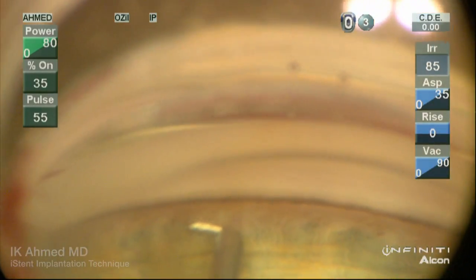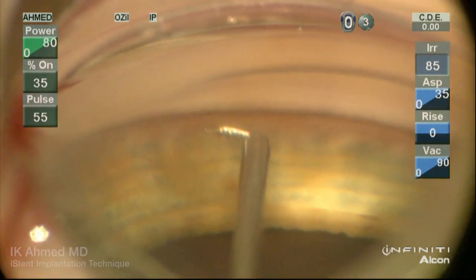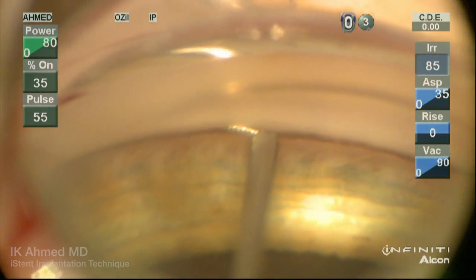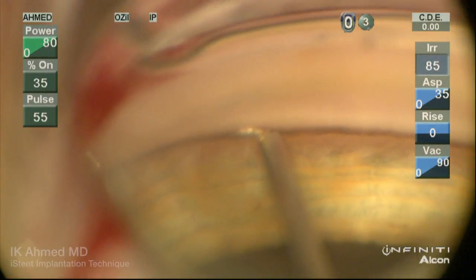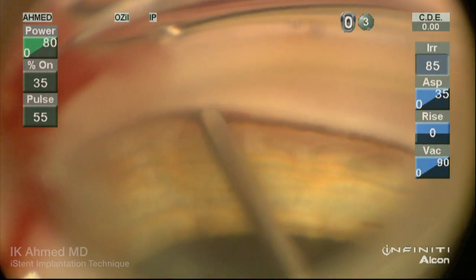In the supranasal angle, we're going to enter the meshwork at a 30-degree angle, noticing the self-trephinating tip approaching the inner wall with this 30-degree acute angle. This allows adequate entrance into the canal, avoiding entrapment within the inner wall itself. Once we get a third of the device into the canal, it's important to lift toward the hand and straighten the hand out to allow smooth passage of the implant within the canal.